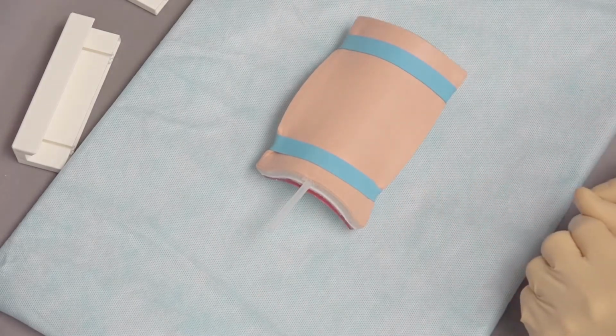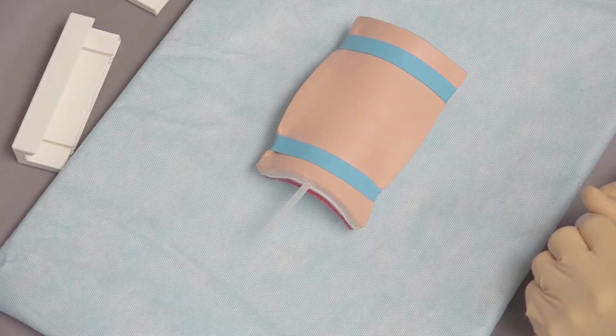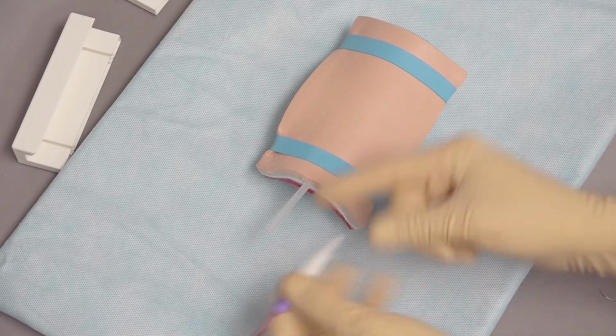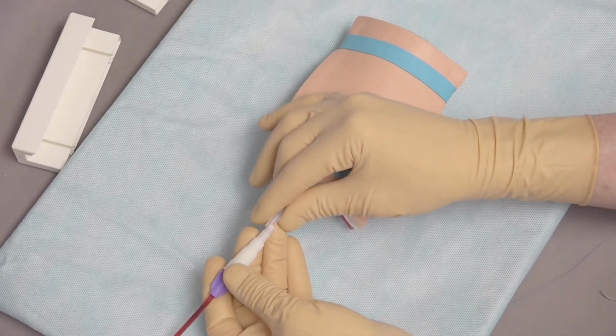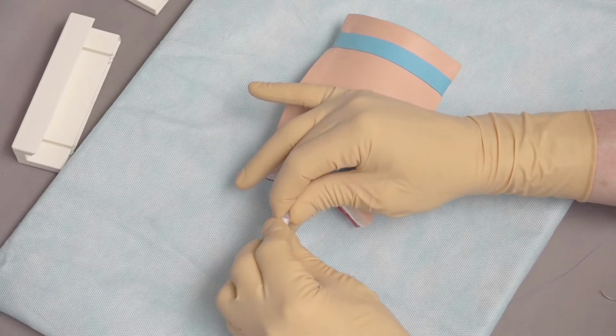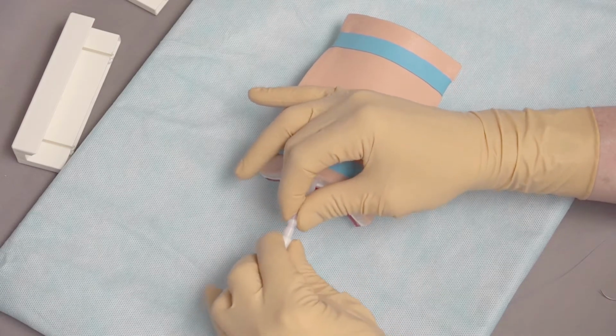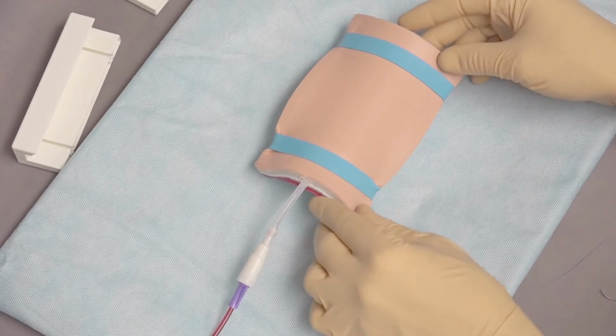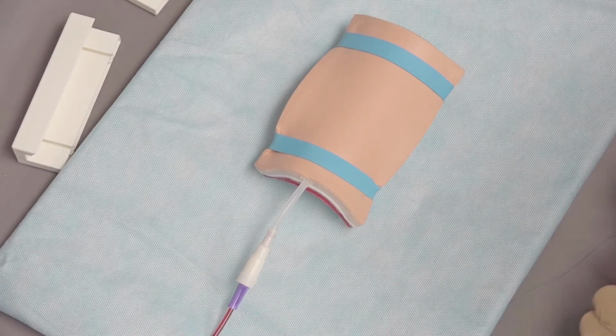Now we want to attach this to a bleeding supply. So in this case, we're using some simulated blood. And we're going to attach that using the end of the blood here onto this tube. This is a little challenging to put on, but if you work on it just to one side then to the other, you can get that on. Make sure you feed it on all the way because you don't want that coming apart while you're working. This blood will stain your clothes, so do pay attention to that.